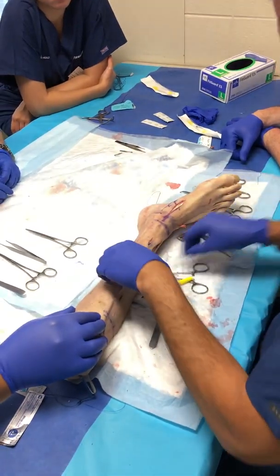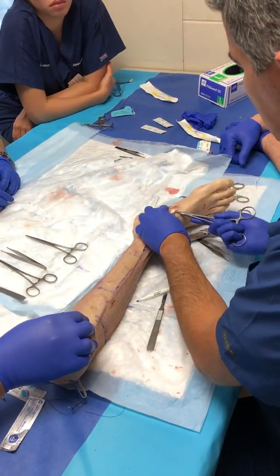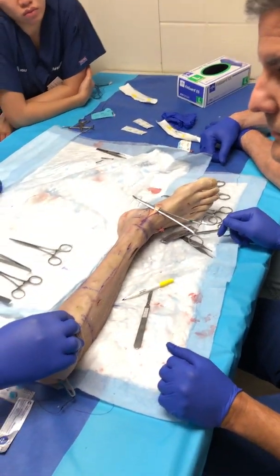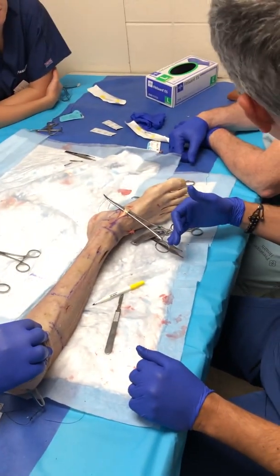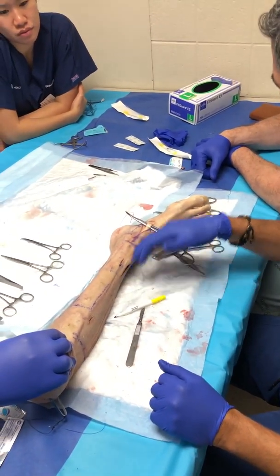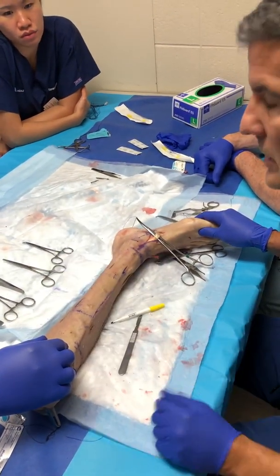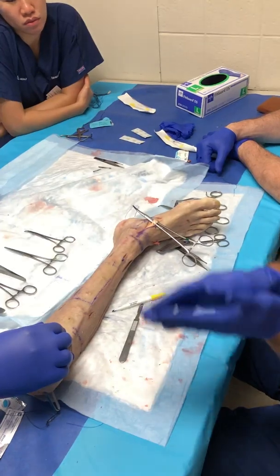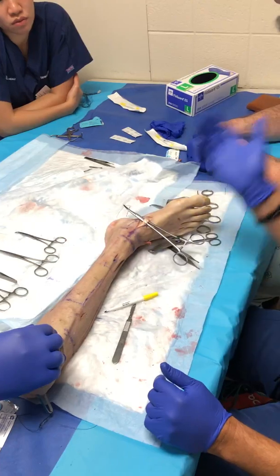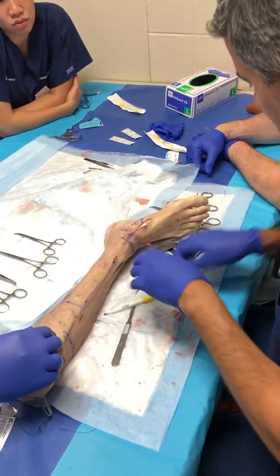And you have, go like this. These tendon transfers are easy, very easy. You have the tibialis anterior. See how everything's about incision. You don't want to go this way, you just want to go slightly at the other side, okay? You never want to make an incision right over the tendon. Everything heals better if the incisions are not done right over it, a little bit medial, a little bit lateral, but not smack center, because the tension of the tendon and the motion may just create adhesions. Common sense, isn't it? Sometimes we don't use it.